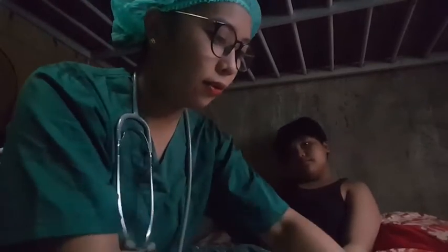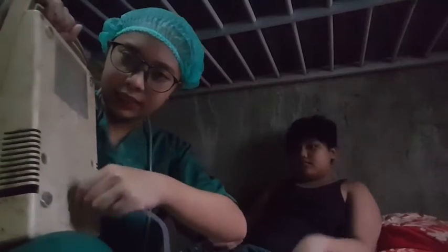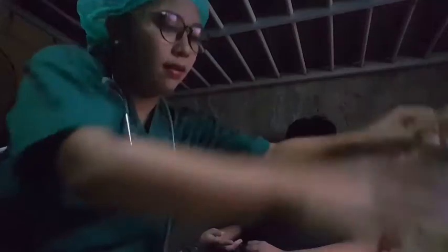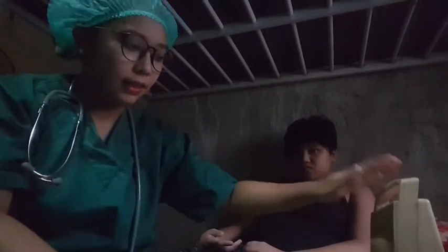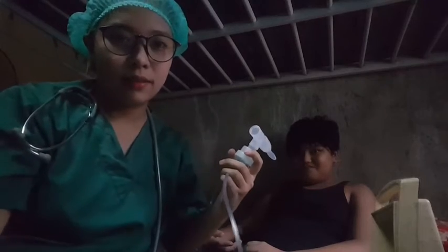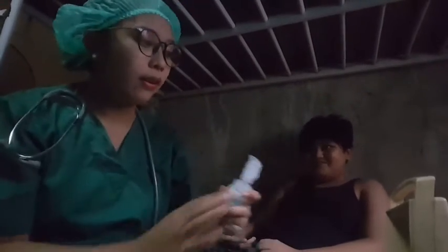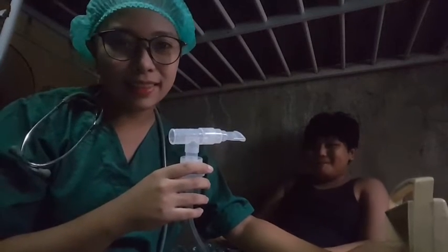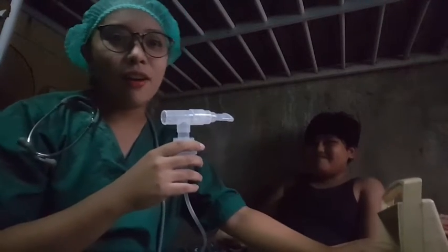So now, by the way, this is an example, not a real nebulizer, but we could connect it here. It's hooked up and ready. Now turn on the air compressor. We're going to pretend that it's on. The fine medication mist is produced in the bulb.